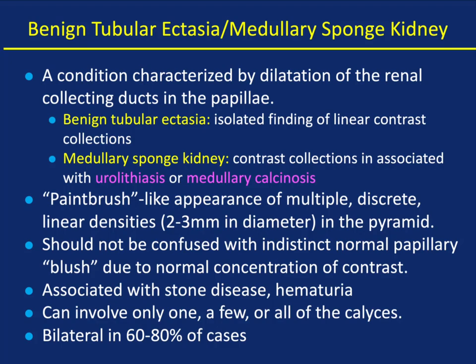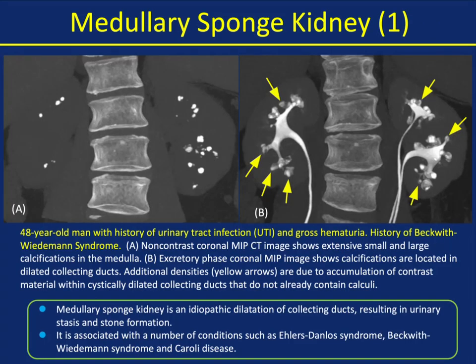Here's a patient with medullary sponge kidney presenting with gross hematuria. The non-contrast coronal MIP images show extensive small and large calcifications in the medulla. The excretory phase coronal MIP shows calcifications located in the dilated collecting ducts. Additional densities are due to accumulation of contrast material within cystically dilated collecting ducts that do not already contain calculi. You can see it's a combination of calyces with and without calculi, but that paintbrush appearance is indeed very impressive.